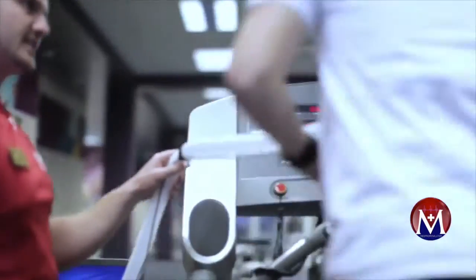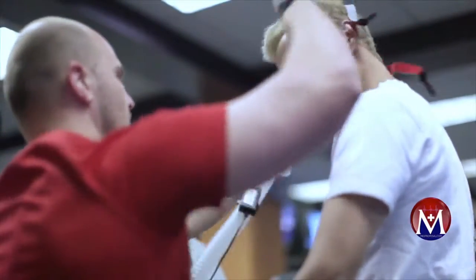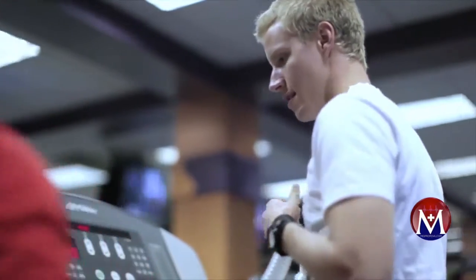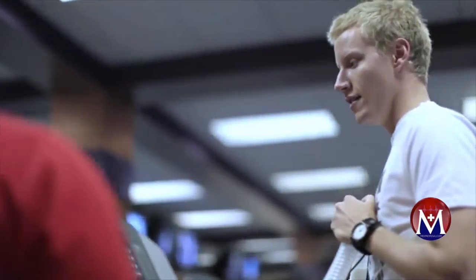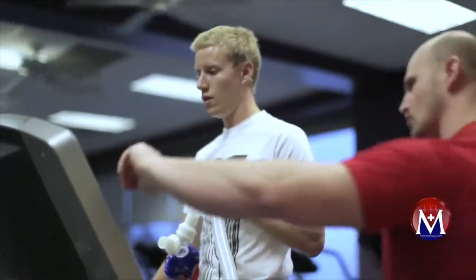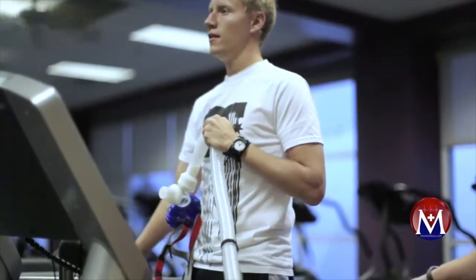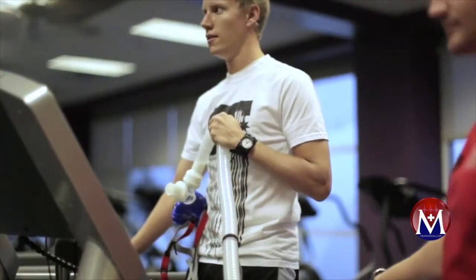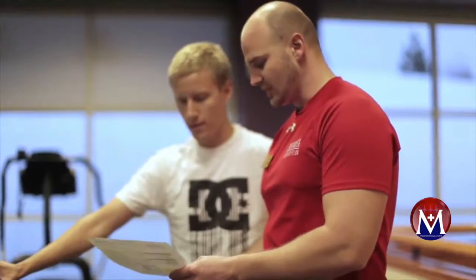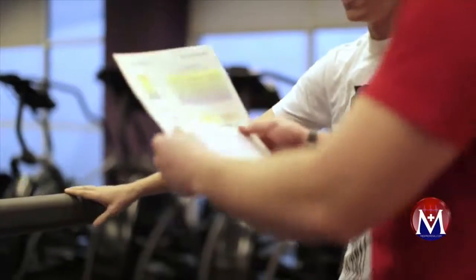My favorite thing about using it is just the amount of data it gives you, and it allows you to be creative as a trainer, as a medical personnel. Whatever your area of expertise is, it allows you to dictate what information you want to give the athlete or the person that you're testing, and formulate a different plan of action for them and how you want to train them personally. And it gives the person that you're testing some confidence that you are directing this personally for them and not just taking a cookbook approach.